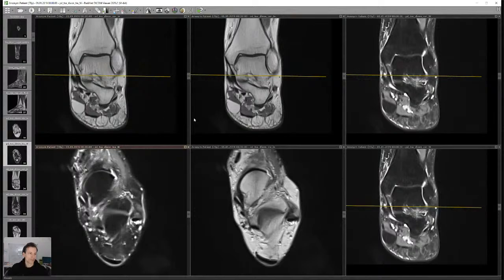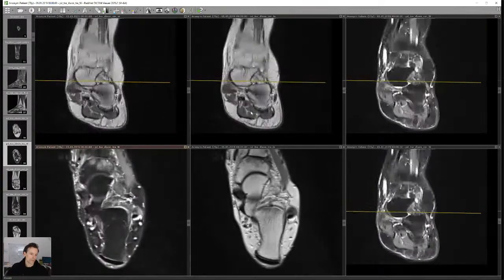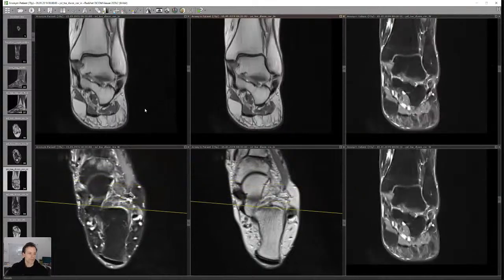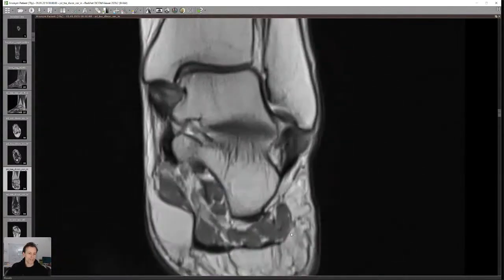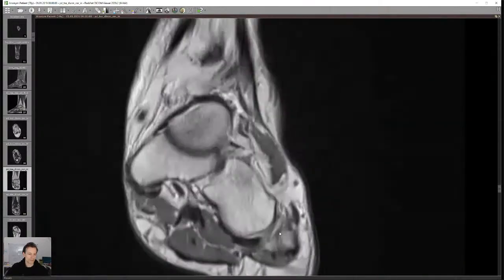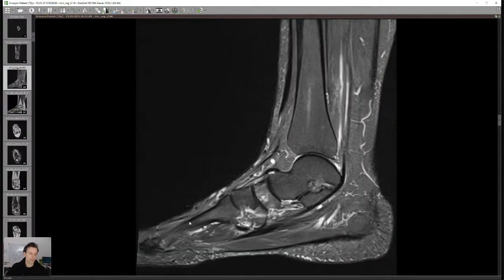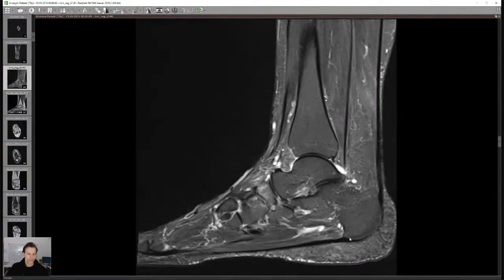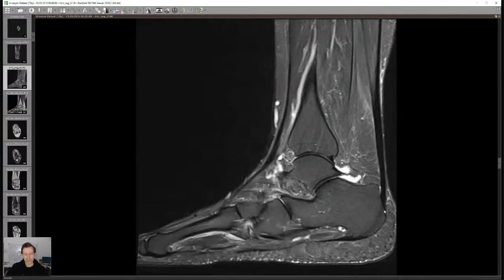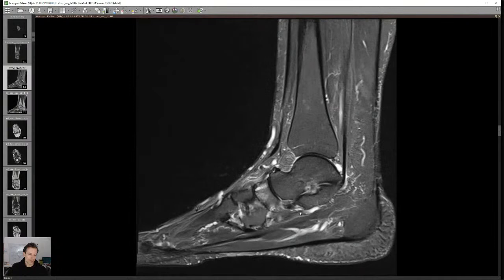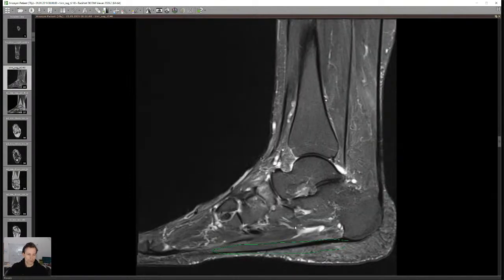Once tendons are done, look at soft tissue: the musculature especially on the plantar aspect — if very fatty degenerated it may suggest diabetes. Check for isolated atrophy of the abductor digiti minimi in Baxter's neuropathy. Look for soft tissue edema in the subcutaneous fat on the plantar side. Also — I forgot to mention — during the tendon assessment always look at the Achilles tendon and plantar aponeurosis at its calcaneal origin. That's basically the complete approach: bones, joints, ligaments, tendons, soft tissue.